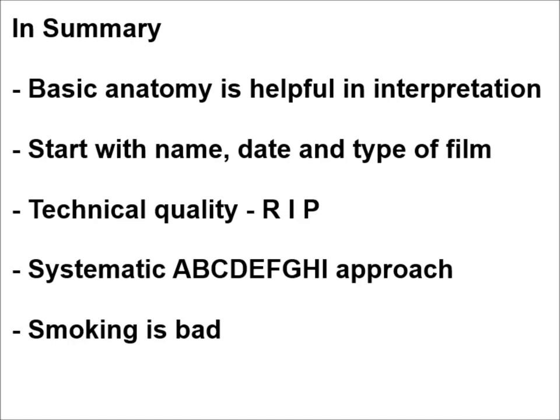Now that we've reached the end, it's time to summarise what you've learnt. A little bit of background anatomy goes a long way in interpreting chest x-rays. Start with the trivial stuff before diving into trying to diagnose the patient. Remember to comment on the technical quality using R.I.P. Use the A, B, C, D, E, F, G, H, I approach, and remember that smoking is bad for you.